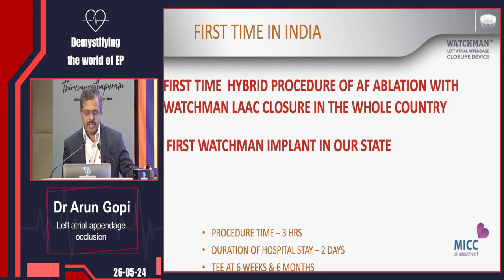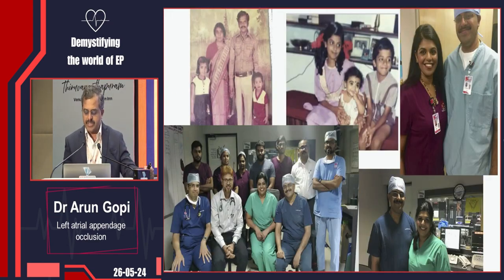He was discharged on day 2, and we have done a TEE at 6 weeks and 6 months for him. There was no intradevice leak, no intradevice thrombus. He's just on aspirin now and has had no episode of neurovascular ischemia after that, and is doing well on clinical follow-up. This was gratifying for me as well, because the whole procedure was proctored by my sister, and special thanks to her for this.